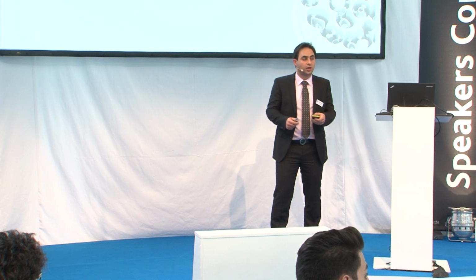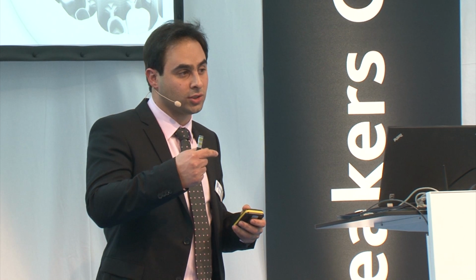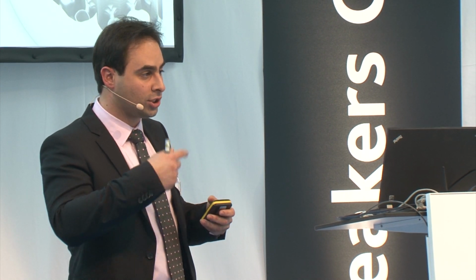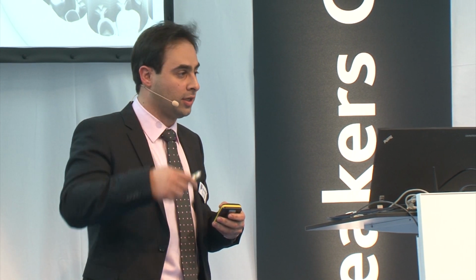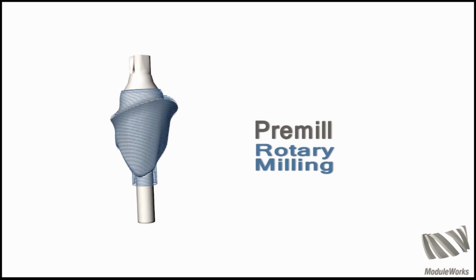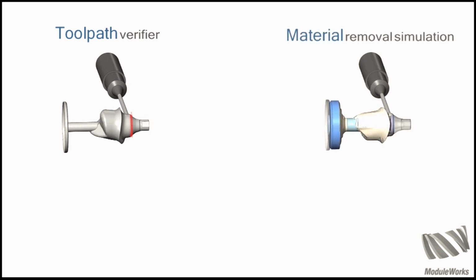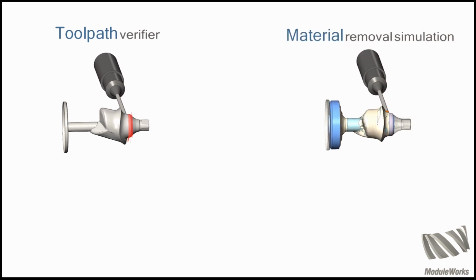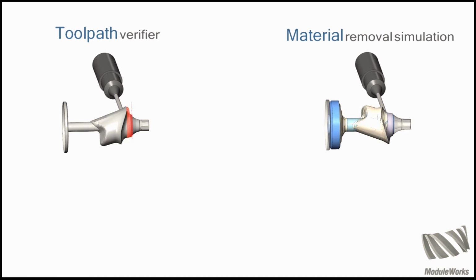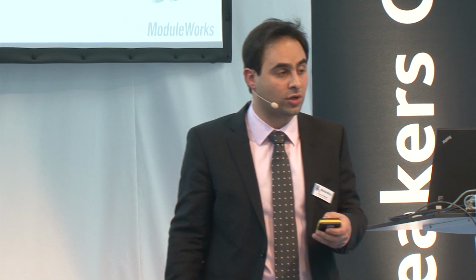There are some machines like the IMS iCore 140, which has just one single slot, and the machine or the part can turn around itself. On these machines, rotary machining is also an option, which can decrease the machining time significantly. You can see here the abutment is turning around itself in a rotary fashion, and then we are machining it. So this sort of rotary machining is available for finishing abutments as well.